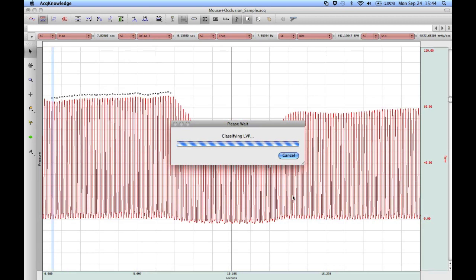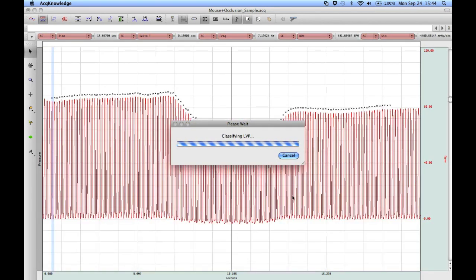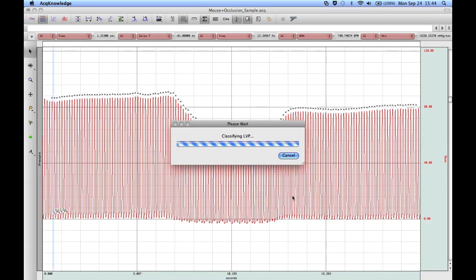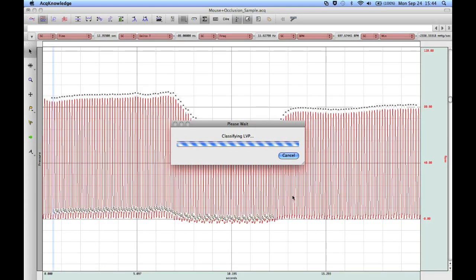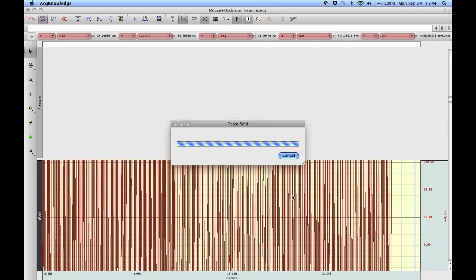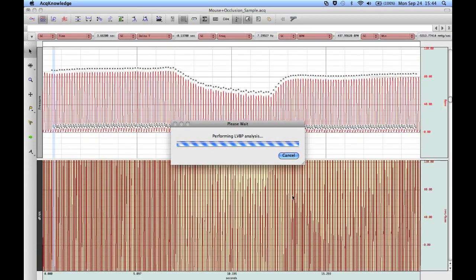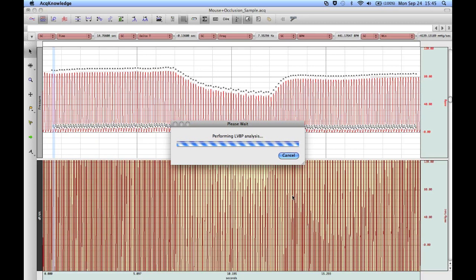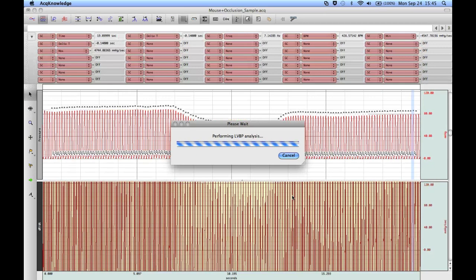The software runs through and scores the data, identifying the systolic and diastolic points. So now it's calculated the derivative, and it's going through and analyzing the data.